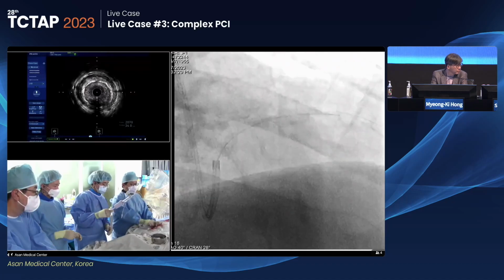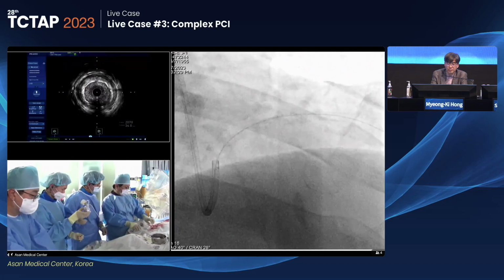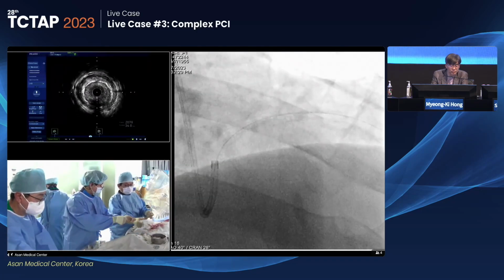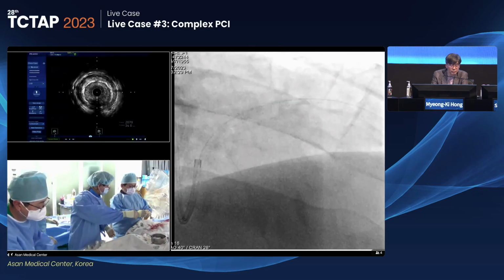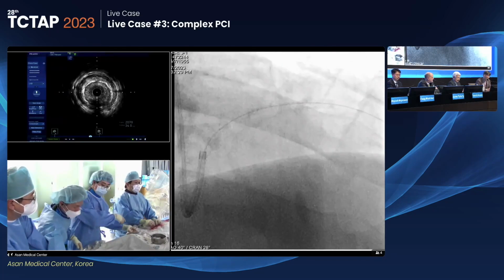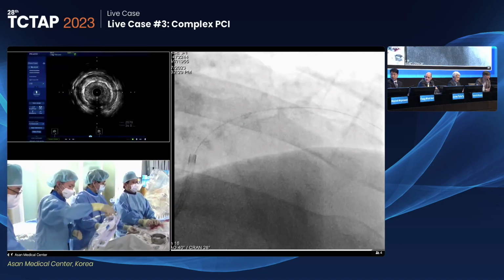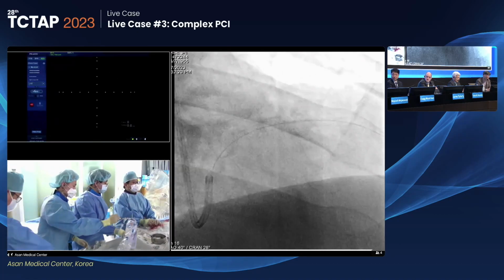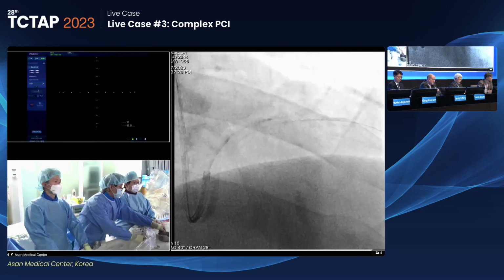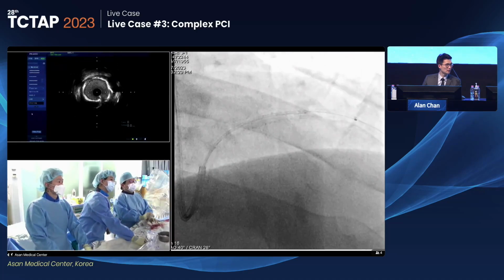Any role for a cutting balloon or scoring balloon up front? Dr., what is your idea about the cutting balloon or scoring balloon to treat the stenotic lesion? I think it depends on whether you're going to re-stent the affected area or not. I think the angiographic result is quite decent after just the high pressure balloon. It gave pretty soft neointimal hyperplasia, not calcified or very tough fibrous tissue.